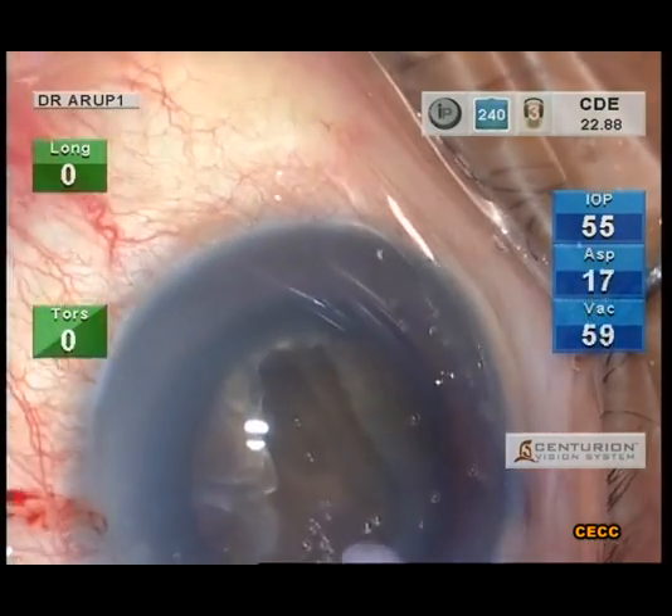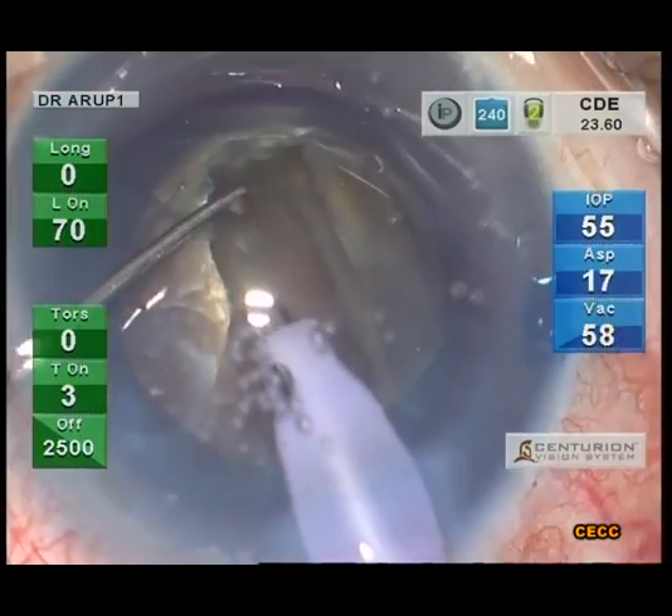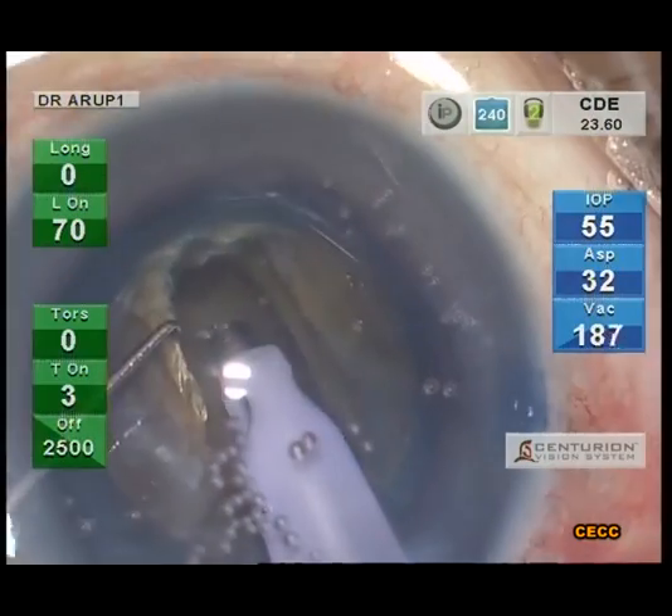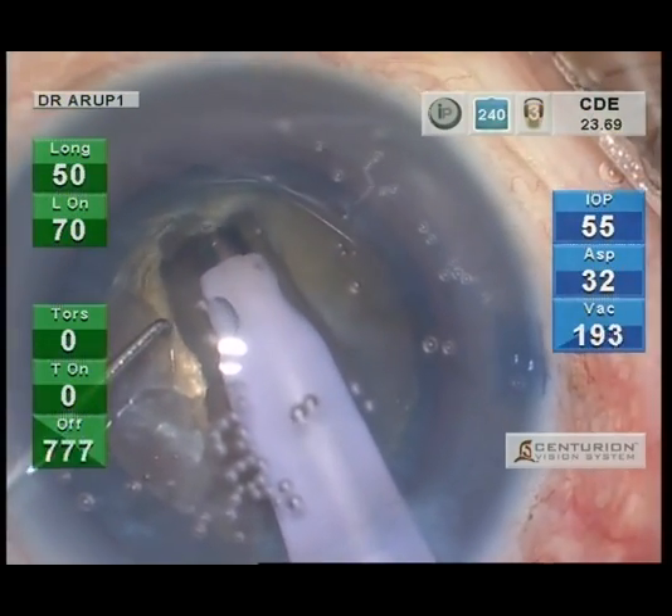Once the trenching is adequate, it is time to chop. The balanced tip is drilled into the distal wall of the groove, thereby pinning down the nucleus for it to be chopped.